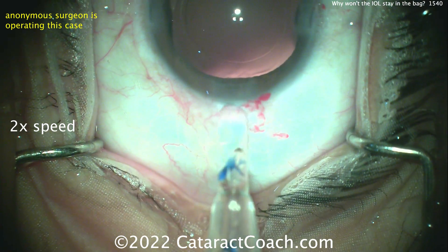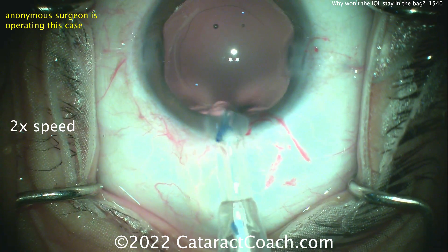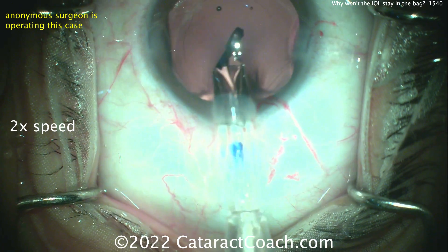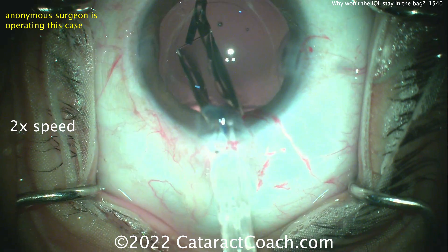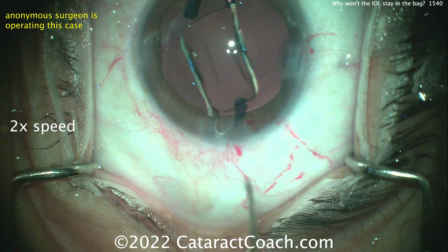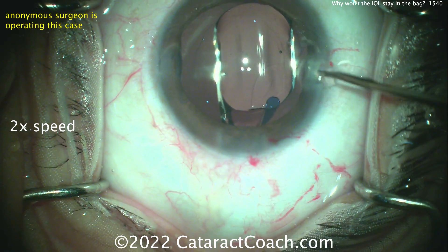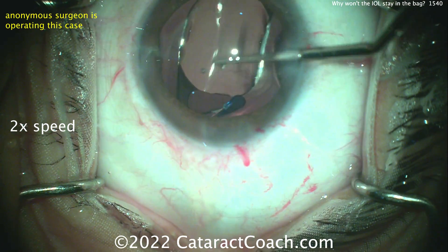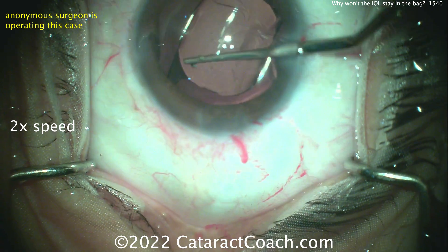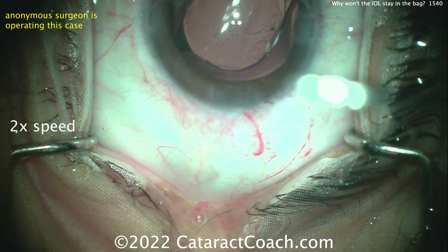Now time for the IOL. In this case, the IOL does not want to stay in the capsular bag, and we're going to try to figure this out together. Here comes our lens — looks like an acrylic lens going into the capsular bag. Orientation is correct. The leading haptic looks like the number 7, trailing haptic the capital letter L, and it's going into the bag. That looks like it's in the bag to me. I wish the camera were a little better centered, but we'll live with it.